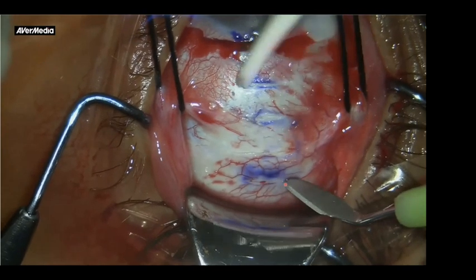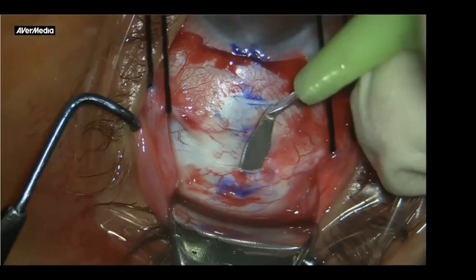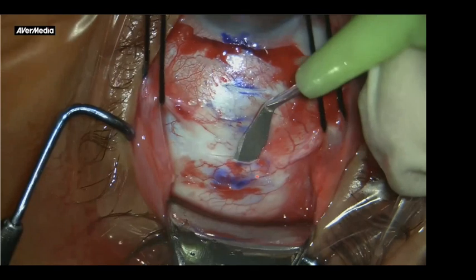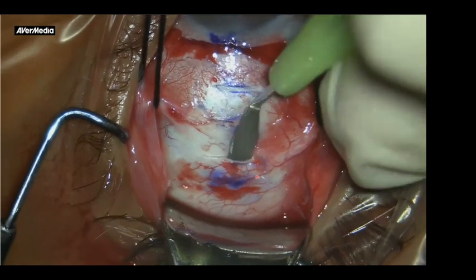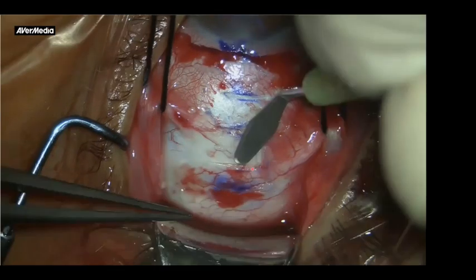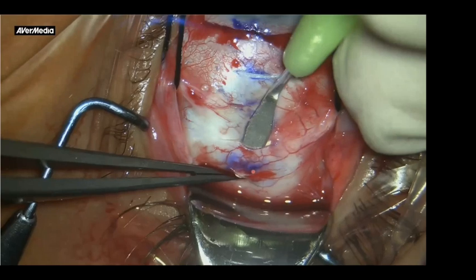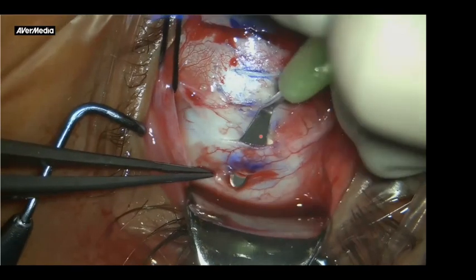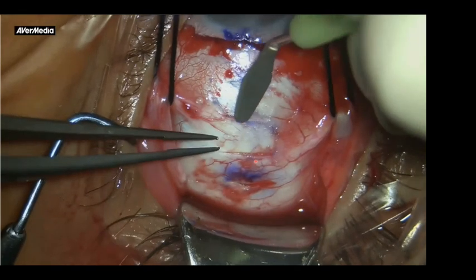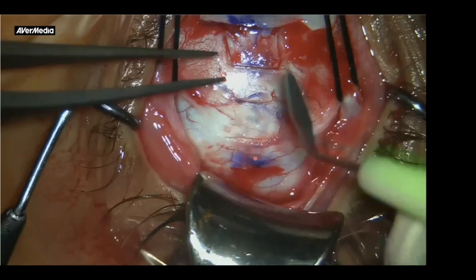And then after I did my incisions again, dissecting the posterior tunnel, I found it easier to have the direction of the crescent from proximal to distal, so from the cornea backwards. This is much more convenient. Yes, you can do it from backward forwards, but again, I found this one is convenient for me. And I'm sitting again in the upper temporal quadrant.